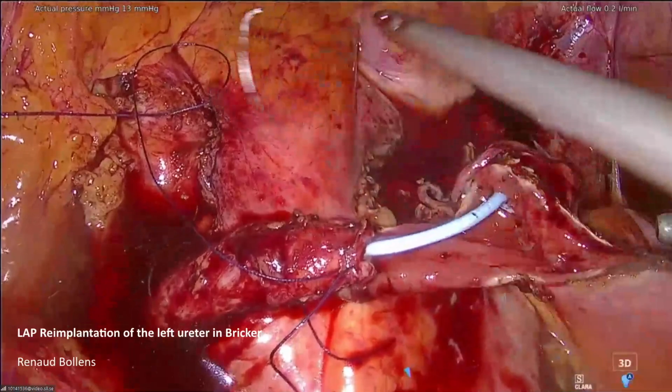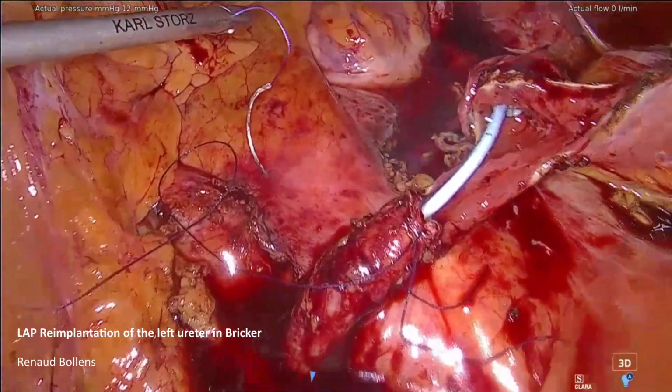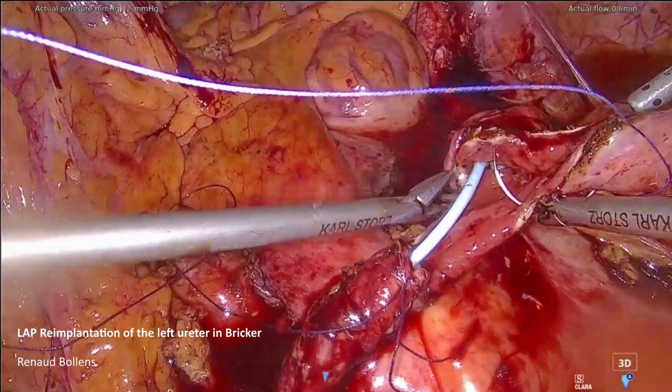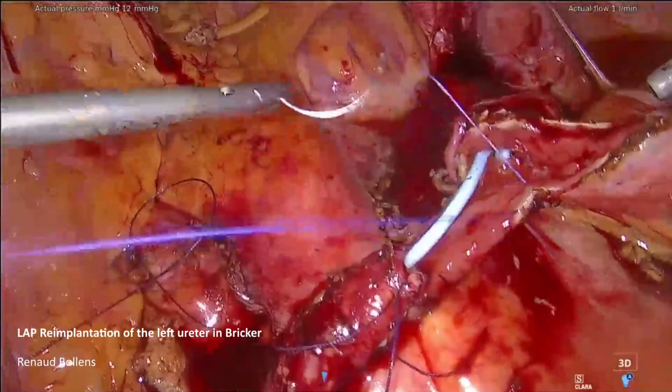It's a point of discussion that exists also. Some people pass the stent in the same manner like that, but it's true that we increase the risk. I will see after what I can do, if I can fix it or not, to try to minimize this risk. I don't know yet. Honestly, I invent the technique step by step today just for you.